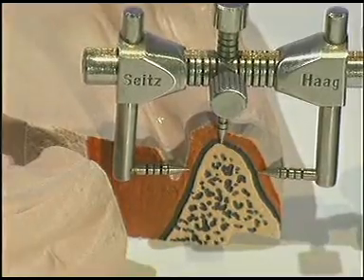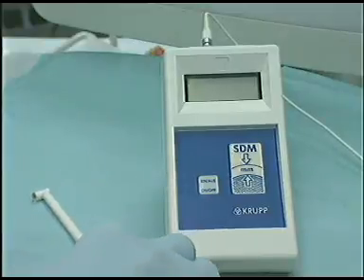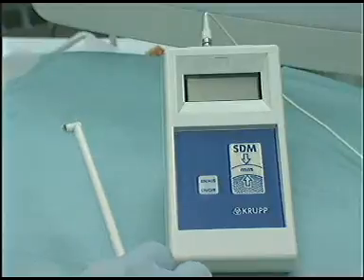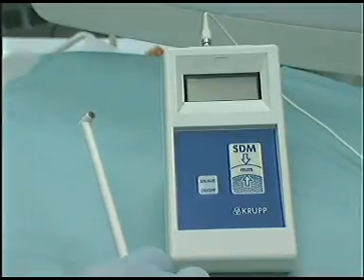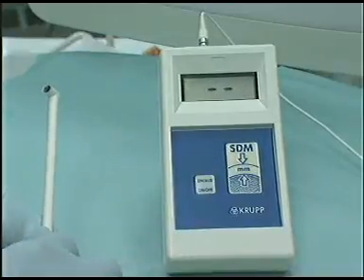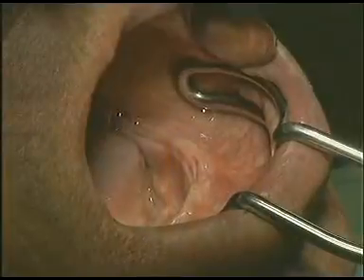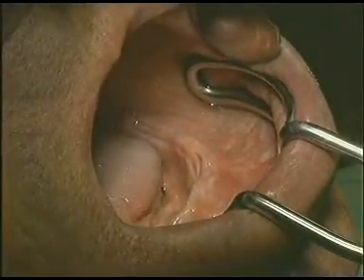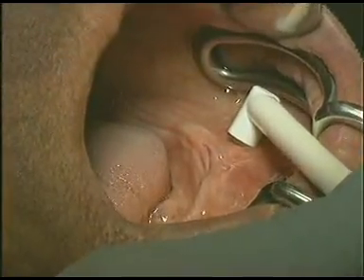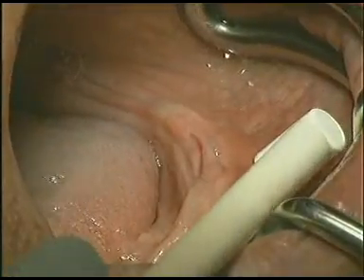These recordings can also be taken with small ultrasonic units, which do not cause bleeding or pain. This mucosa thickness measuring unit uses the impulse echo principle. Once the unit has been switched on, it calibrates itself automatically. The ultrasonic probe is then used to measure several lingual and buccal areas. The probe must be perpendicular to the bone surface.